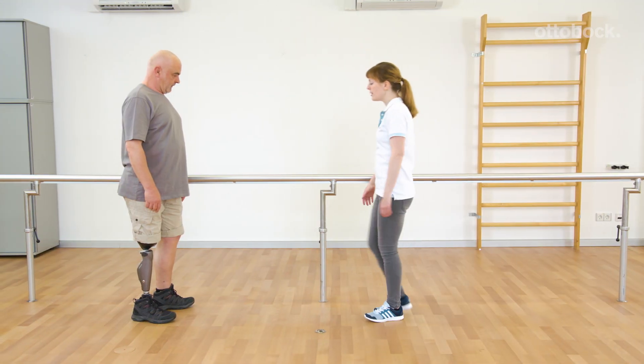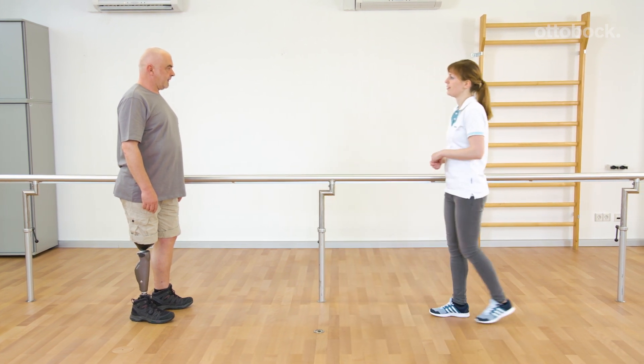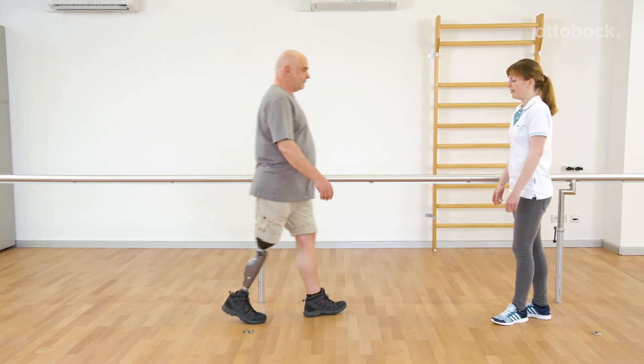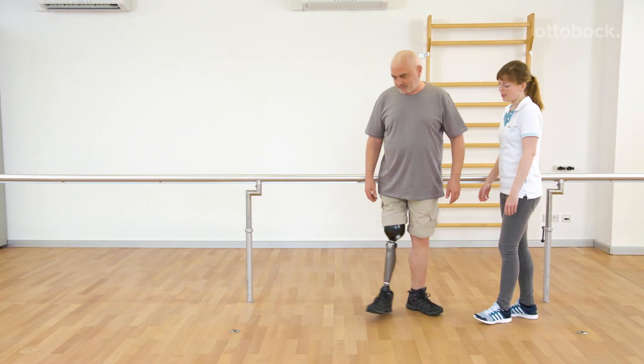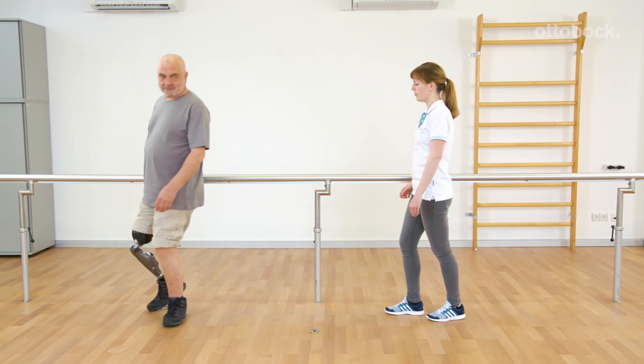Franziska shows Gerhard how to stop a movement using a yielding step. He yields into the knee joint and uses the resistance to slow down the movement. The contralateral leg is relieved. This is also possible for higher velocities.